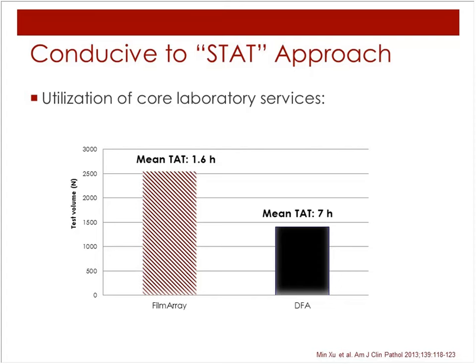In line with that is the fact that the FilmArray respiratory panel EZ is now approved as a CLIA-waived test by the FDA, which is kind of a game changer and will allow for further decentralization and bring testing even closer to the patient.